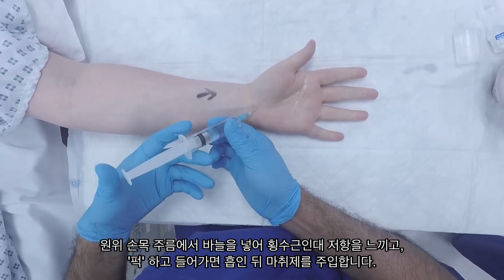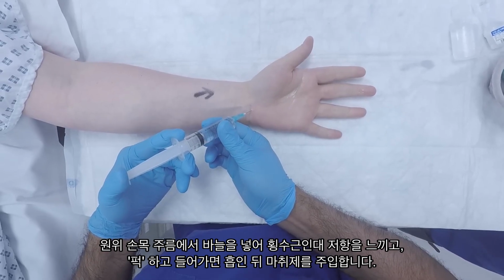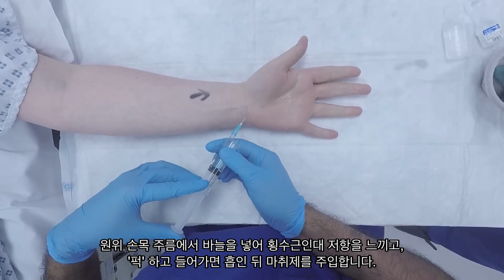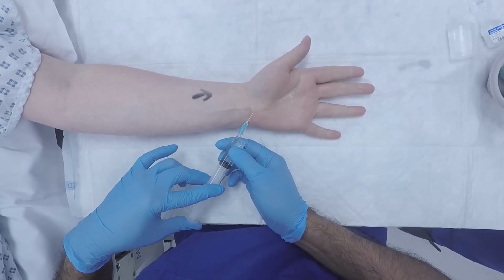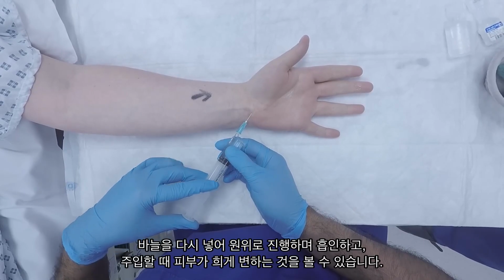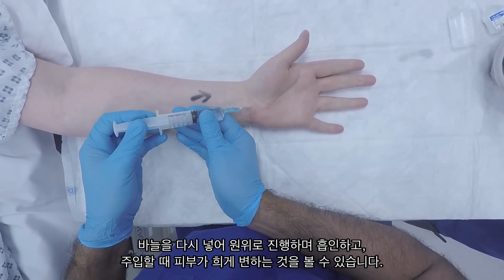There shouldn't be any resistance as you do this, and the patient will often feel tingling in the sensory distribution of the median nerve if you're in the right place. Keep injecting as you withdraw the needle until you get to the surface of the skin, then raise a small bleb. Reinsert the needle in line with your incision, moving distally, aspirating as you go, and you can see the skin blanching here as we inject.